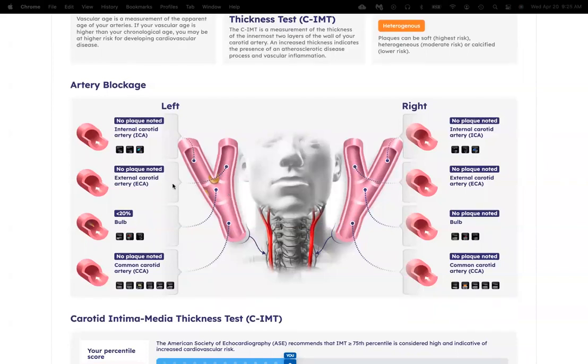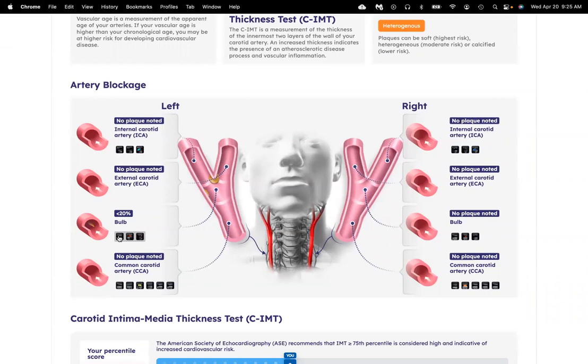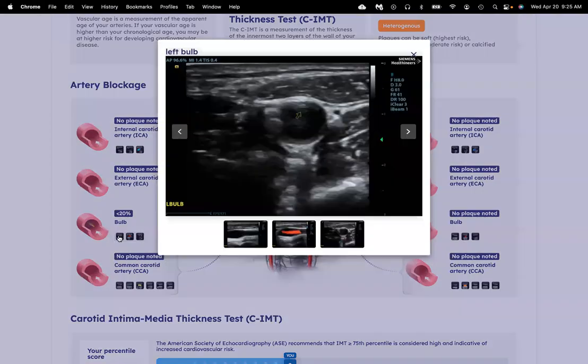The really great thing about the report is that you can click on these boxes and pull up your actual ultrasound images.